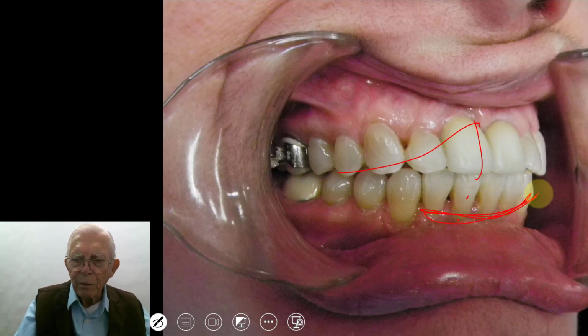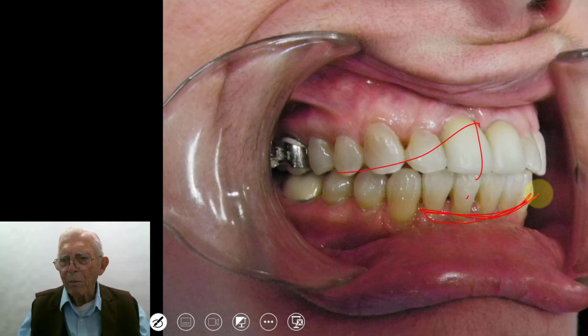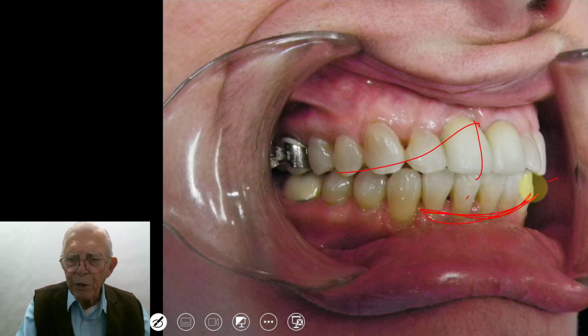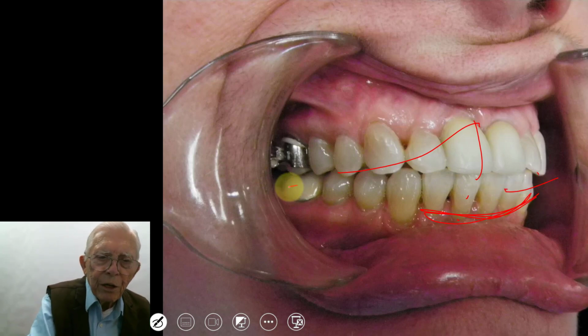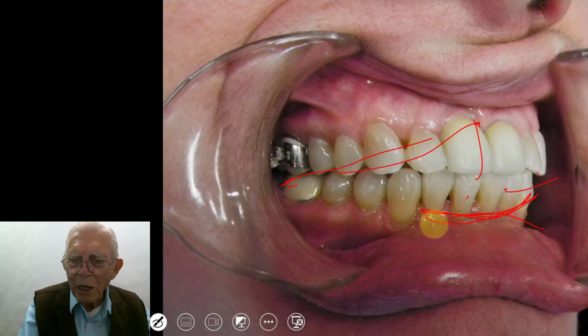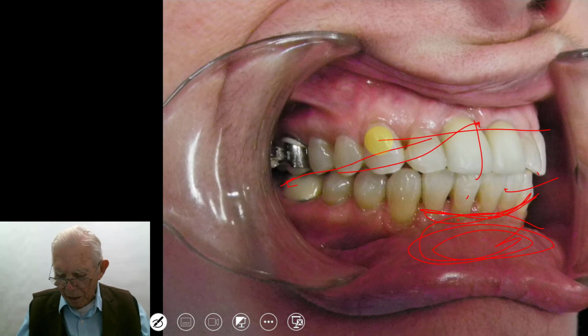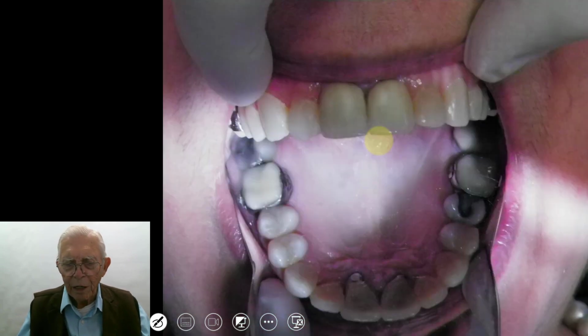And we had space between the lip bumper. It's got to have a millimeter or so of space in there so that none of this lip pressure goes down to here. And then you can put a hook on there with class 2 elastics, and you can take this lip down here and move the upper front teeth backward with that. And so we reduce that down like that.